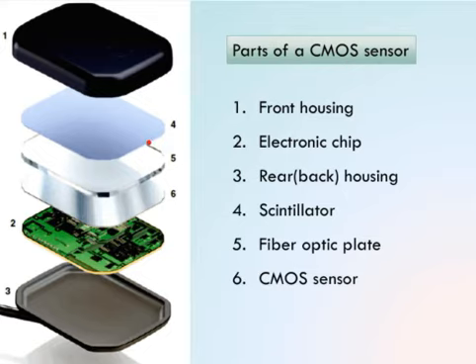Now, number 4 is a scintillator. The scintillator has functions similar to the intensifying screen that is used with extraoral imaging. In extraoral imaging with the help of films, we usually place the films sandwiched between two intensifying screens, supported by the cassettes.